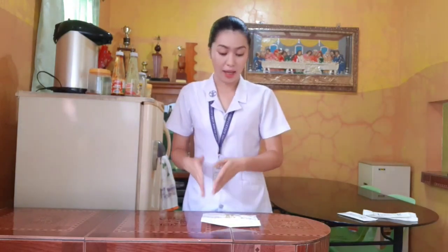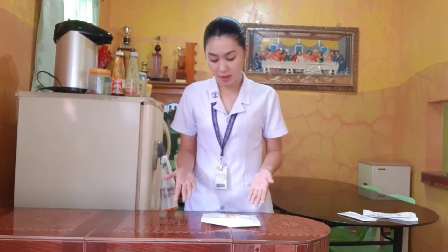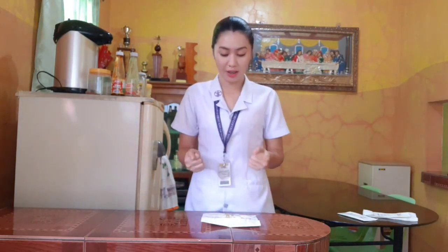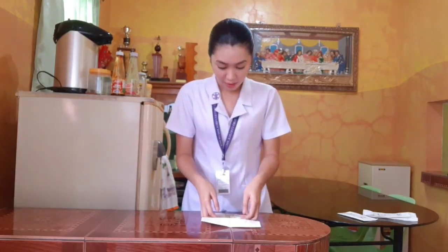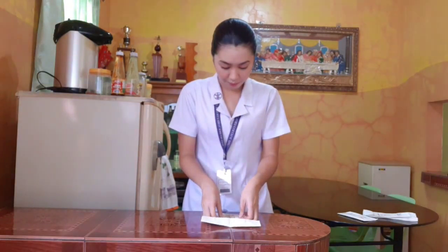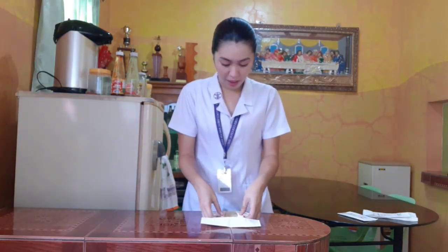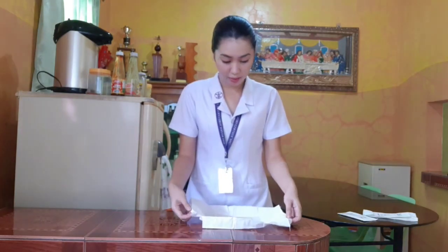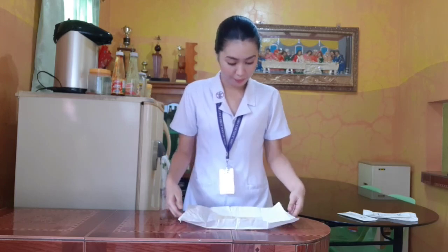And we're going to identify now the left glove and the right glove, which we can actually see here in the inner package as we open it. Okay, now I have seen which is the left glove and the right glove. I think we're good now to open the inner package to expose our sterile gloves. Carefully opening it. Make sure that we don't touch beyond the 2 inches boundary here to keep its sterility.